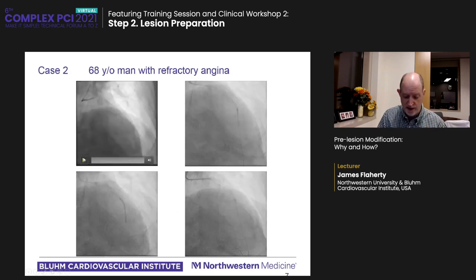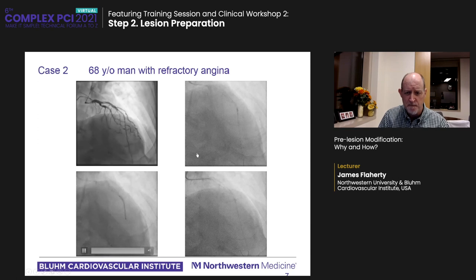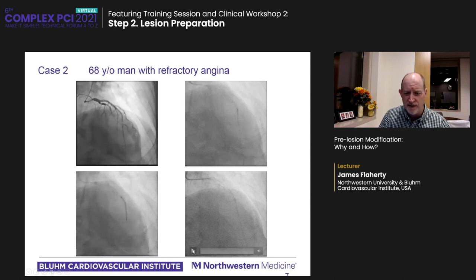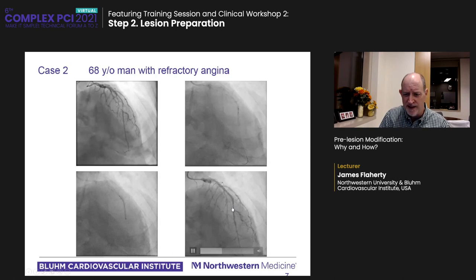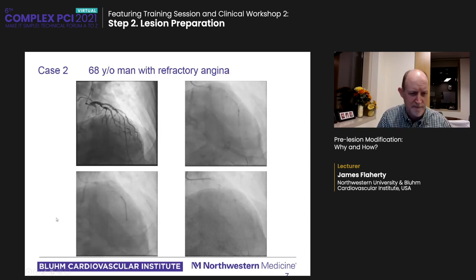Here's another case, 68-year-old man, refractory angina, very tight mid-LAD lesion, moderately calcified, predilated, stent easily goes in, a long stent here, and then attempt to post-dil. You see that dog boning there, very severe lesion. Did not expand. Here's an angiogram, mid-stent, very tight stenosis remaining. I'll get back to this case in a little bit.